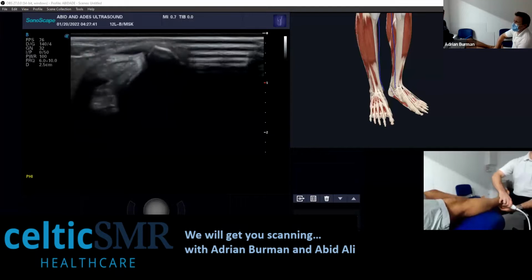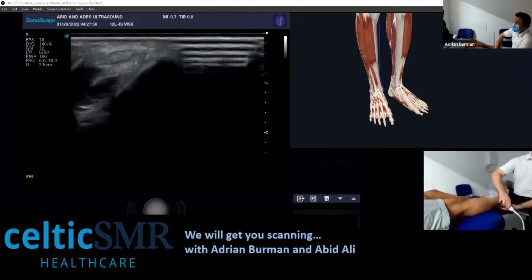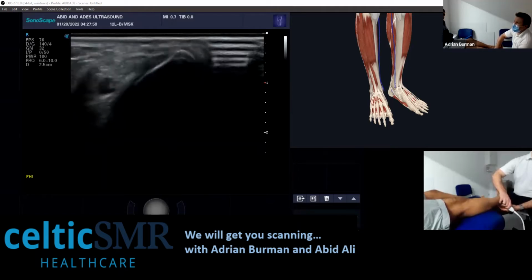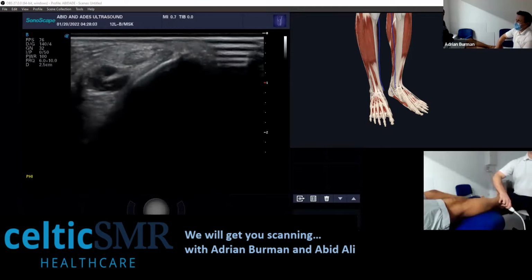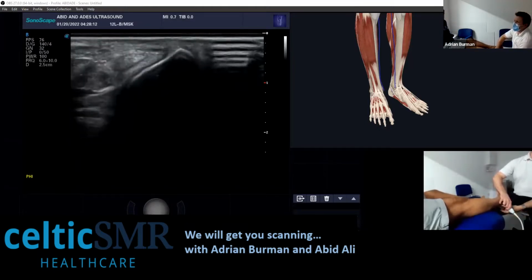Yeah, so you can see it moving there. Now I tend to look for what's called the Pac-Man sign. If the brevis is splitting and engulfing the longus, I can tend to see that. Then when you dynamically evaluate, it may suddenly shoot back, or even if it's a split tear, it'll engulf it. But yeah, you can get snapping of that tendon.